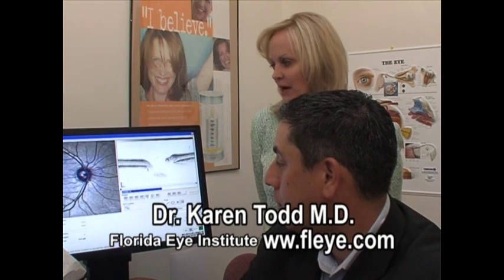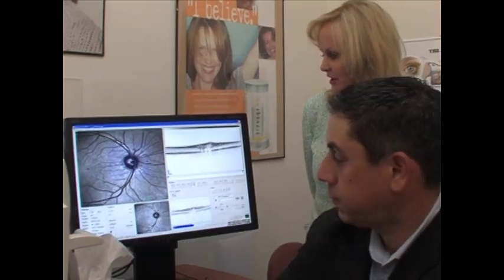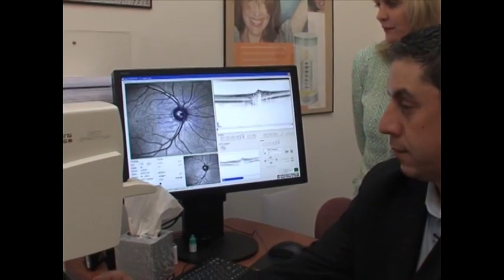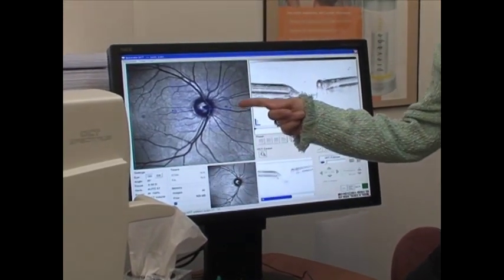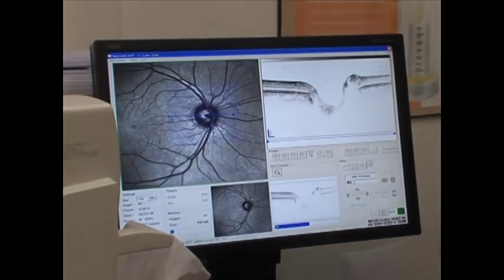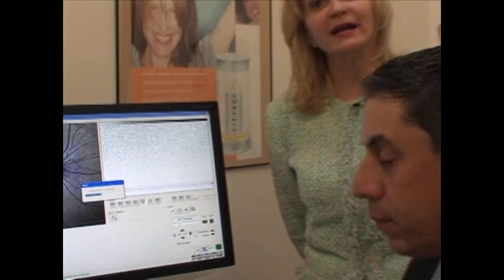This is the image of her optic nerve. It's making a grid, going from bottom to top and making a grid image of her optic nerve. You can see how the arrow is going up. For demonstration purposes today, we're only going to do Lynn's right eye, but ordinarily we would do both eyes of the patient and compare them.